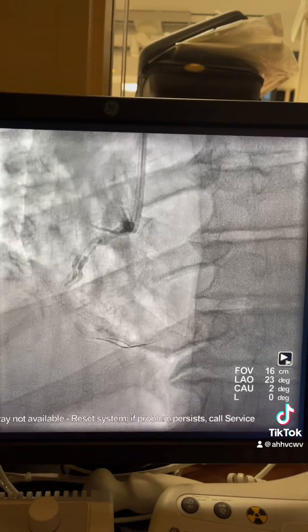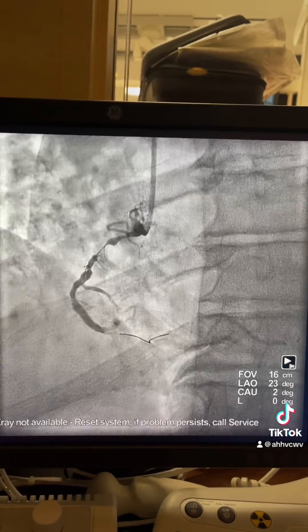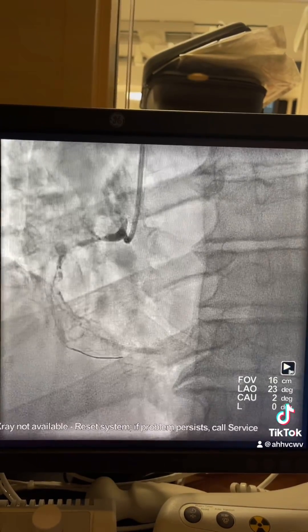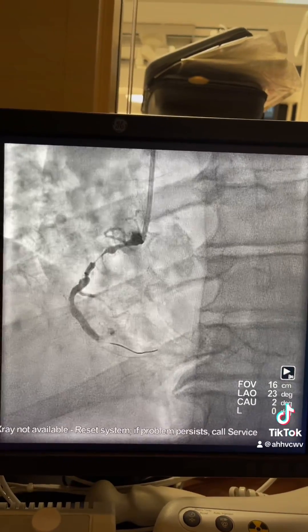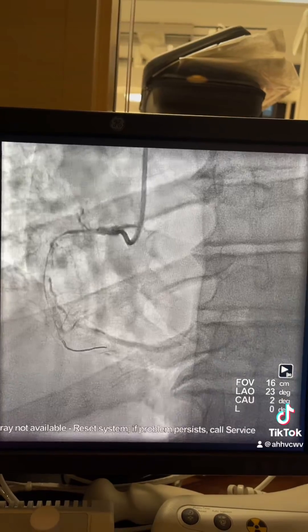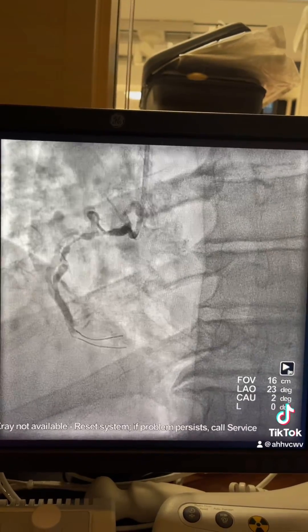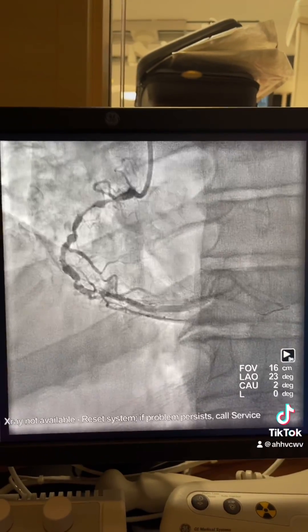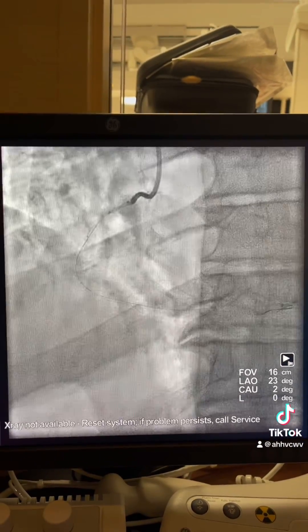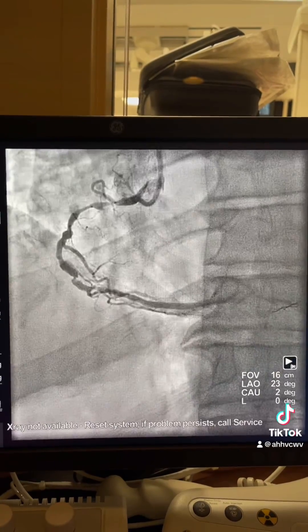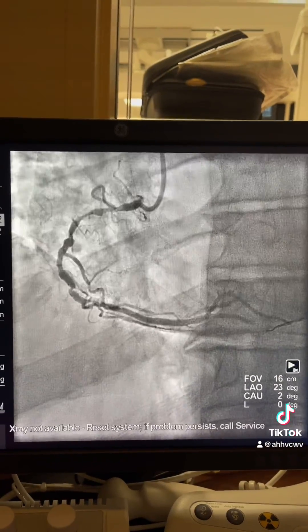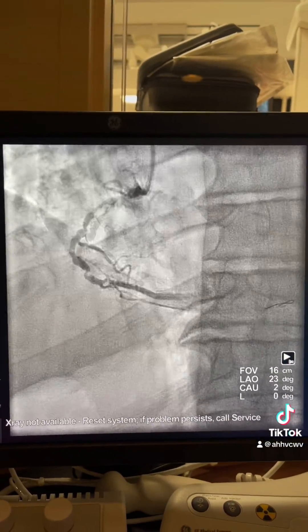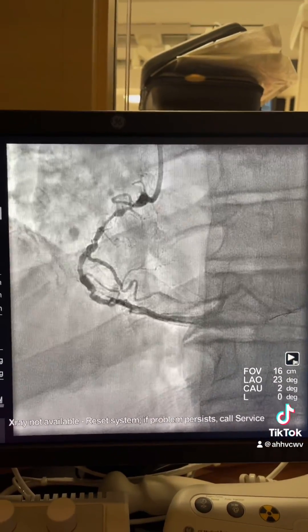Post multiple inflations in the proximal and mid segment, we can visualize the distal RCA. Redirected the wire to distal RCA toward PDA, then performed multiple inflations with an upgraded balloon.